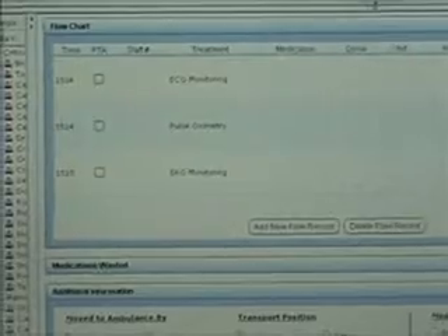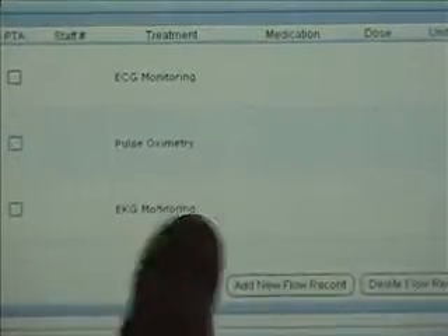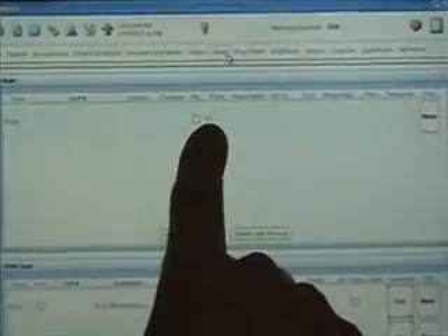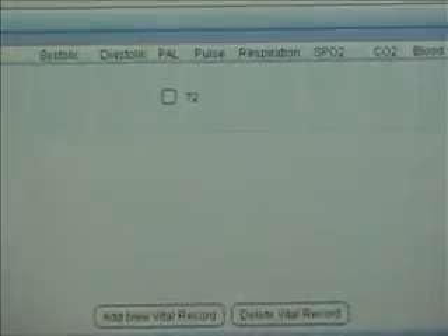Now we're going to look at two things: the flow chart and the vital signs. Notice the flowchart has EKG monitoring — this may be two separate 12-leads or just when you turned on the monitor. Make sure that reads 12-lead or ECG monitoring, whatever's appropriate for that activity. Also notice pulse ox is in there. If you go to vital signs, there's the pulse ox reading with its timestamp. Just double-check those and make sure they're correct. That's basically all you have to do.